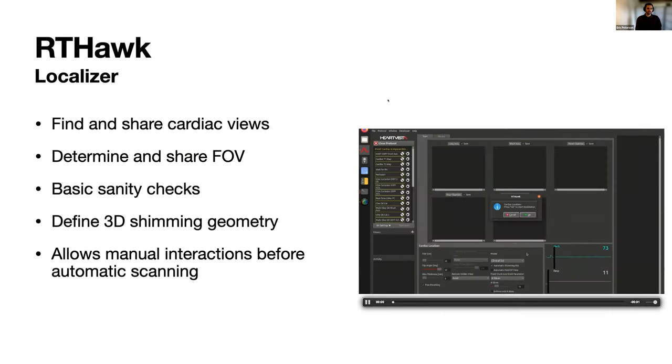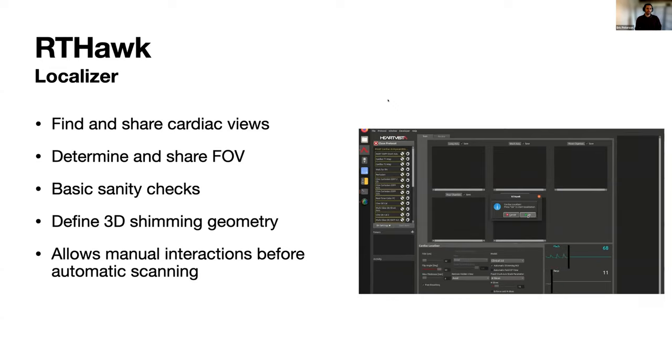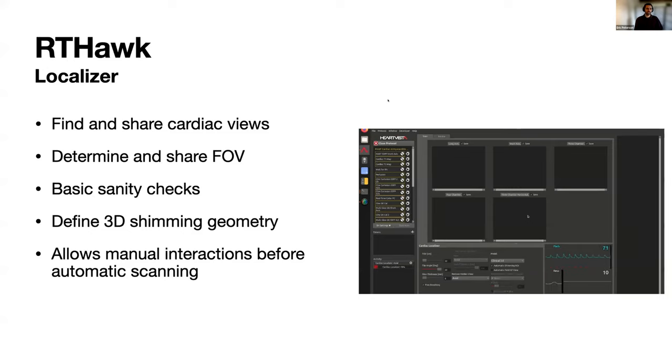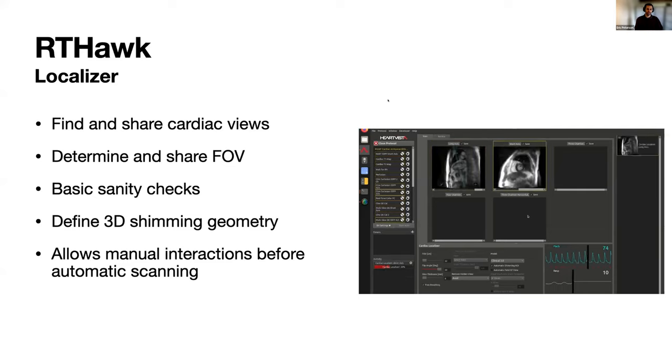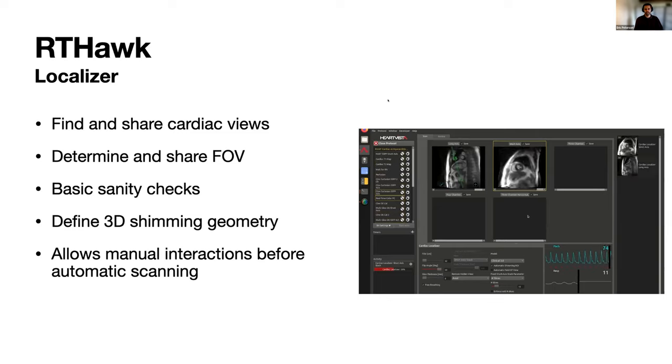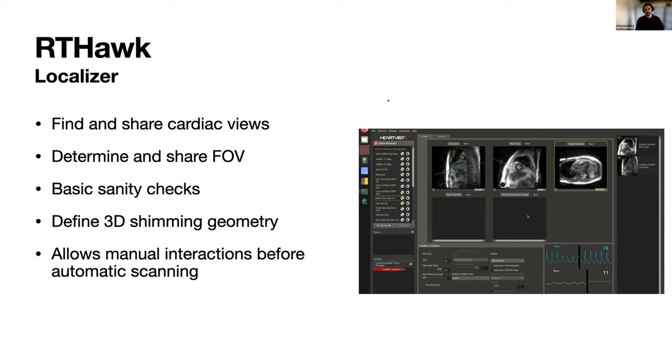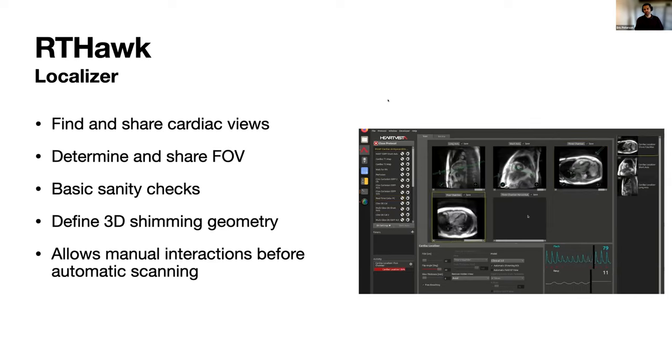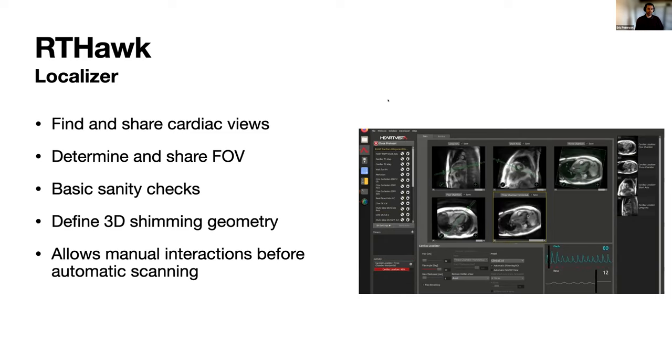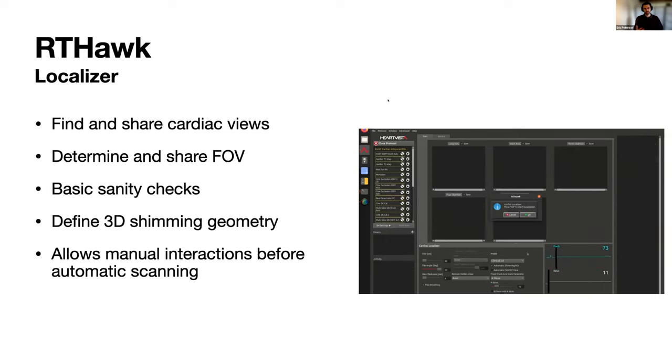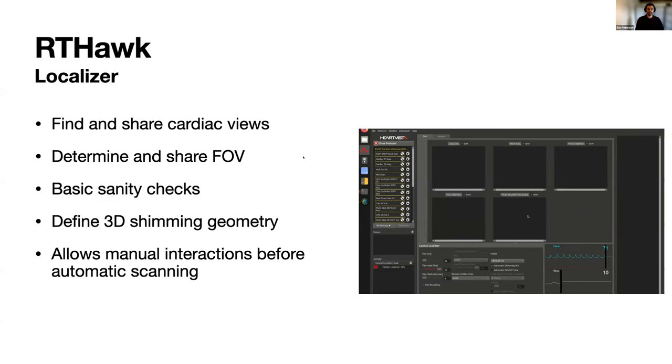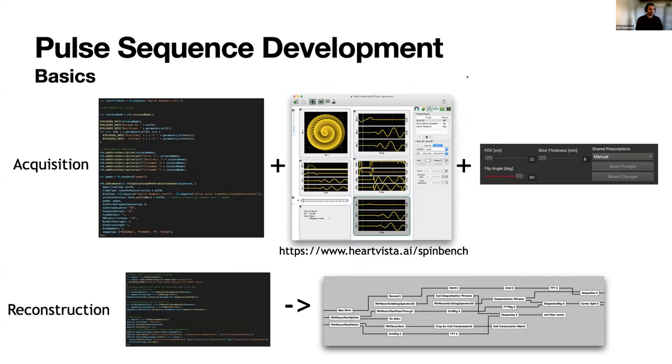The localizer finds and shares the views with all the other sequences that might need it. It can also determine the field of view that we might need—bigger patients might need a bigger field of view. Does some basic sanity checks, SNR things like that. Defines the shimming geometry, so we're interested in the heart here, put the shimming geometry over the heart. And then it's a good point to allow any interaction with the protocol, with the views, before actually starting the rest of the protocol.